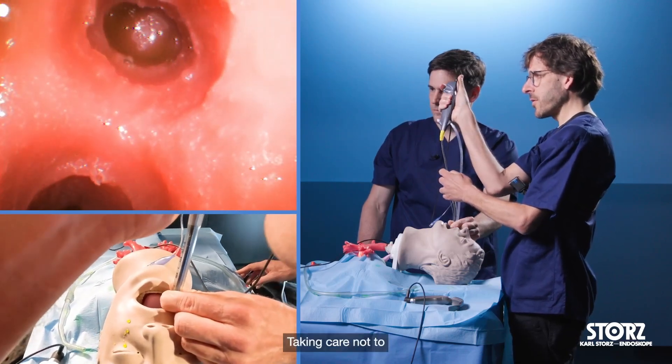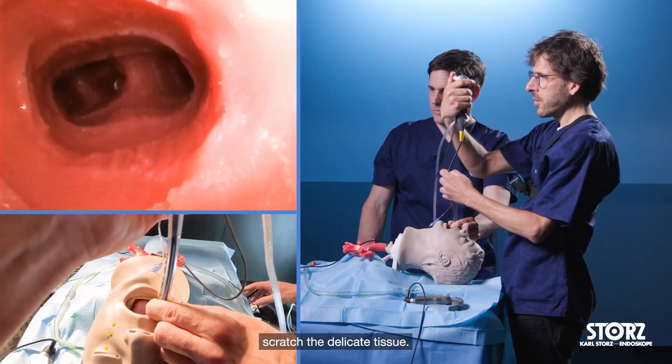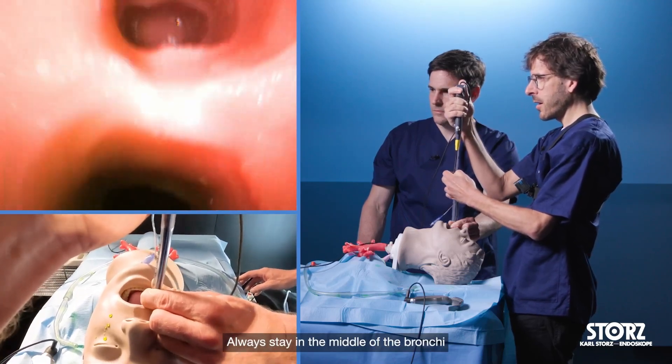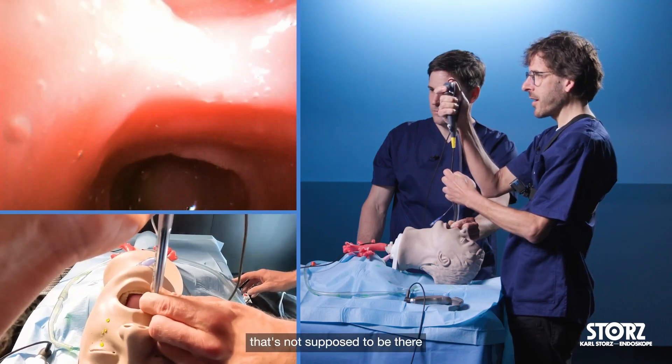Taking care not to scratch the delicate tissue. Always stay in the middle of the bronchi, looking for fluid that is not supposed to be there, until it is clean.